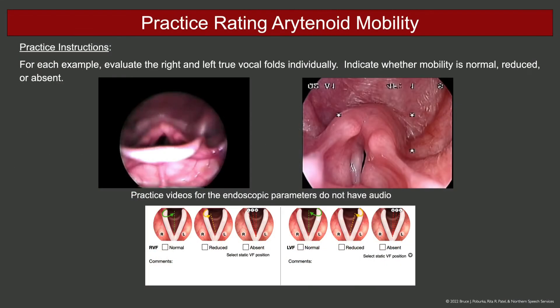Now practice rating arytenoid mobility. For each example, evaluate the right and left true vocal folds individually. Indicate whether mobility is normal, reduced, or absent.